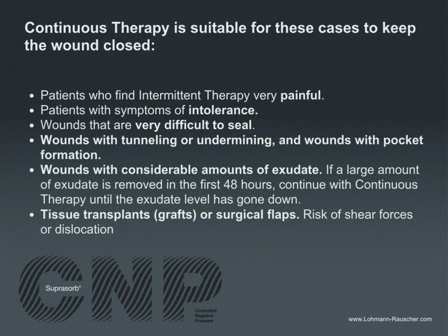If a large amount of exudate is removed in the first 48 hours, continue with continuous therapy until the exudate level has gone down. 6. Tissue transplants, grafts, or surgical flaps. 7. Risk of shear forces or dislocation.